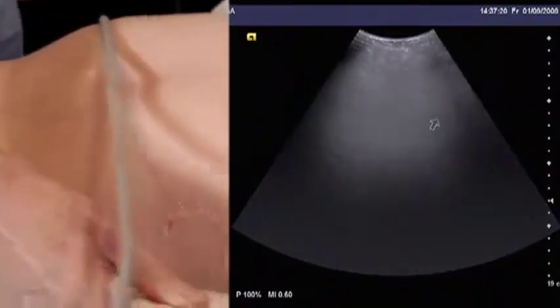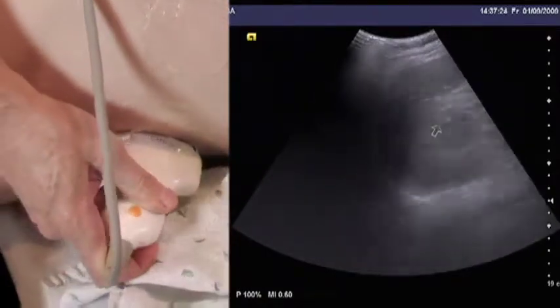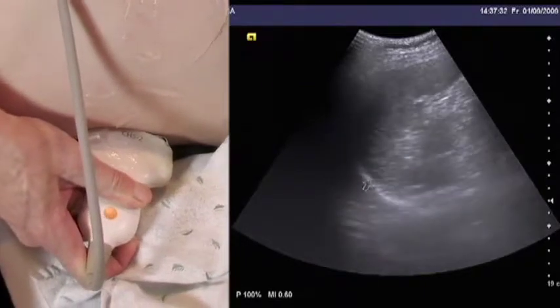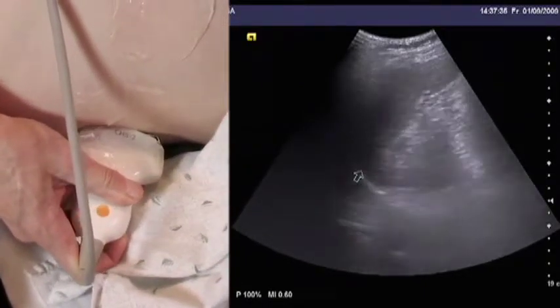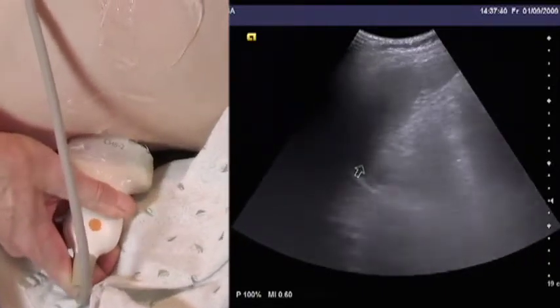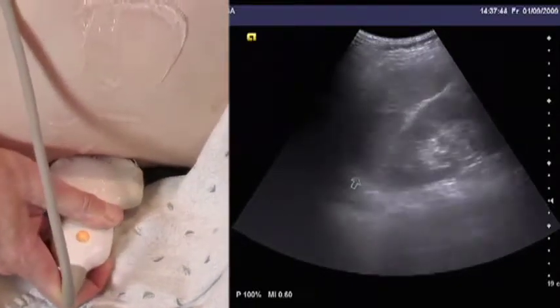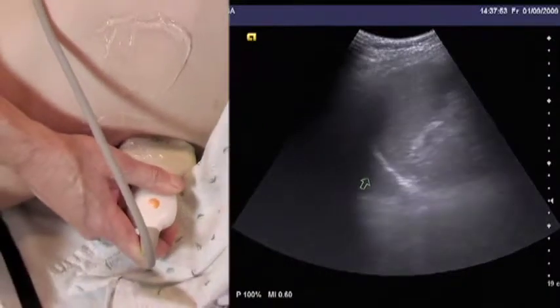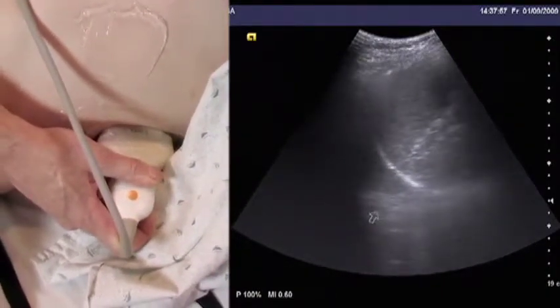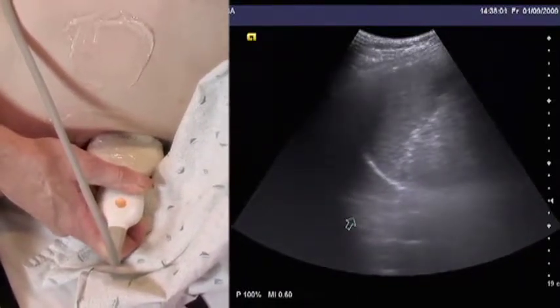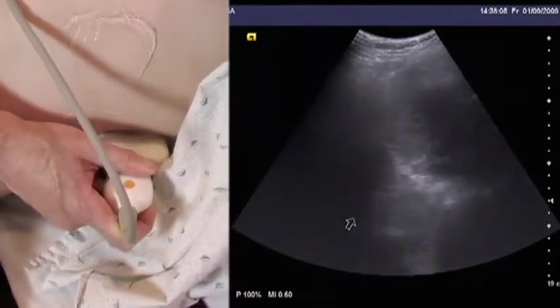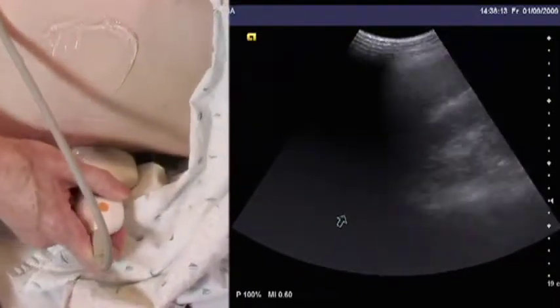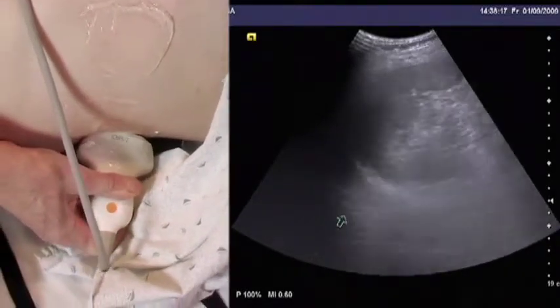In the left upper quadrant, the same four spaces are going to be assessed as in the right upper quadrant. First, we assess the pleural space. Here's the diaphragm again. The pleural space shows the same mirror artifact as on the right, with the appearance of the spleen above the diaphragm. This particular view is probably the hardest in the FAST exam. The mistake most people make when learning is failing to put the probe far enough backwards — my hand is almost touching the bed — and failing to put the probe far enough cephalad, up towards the patient's axilla. The diaphragm is a much higher structure than people often realize until they start doing ultrasound.